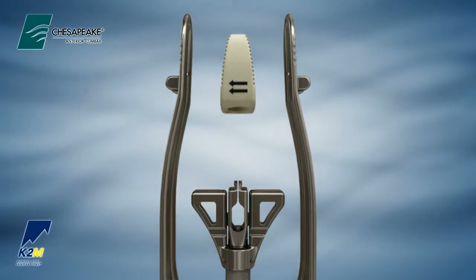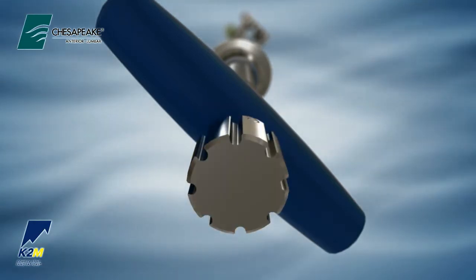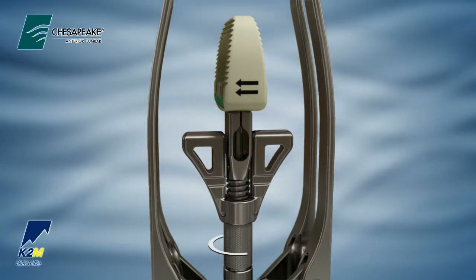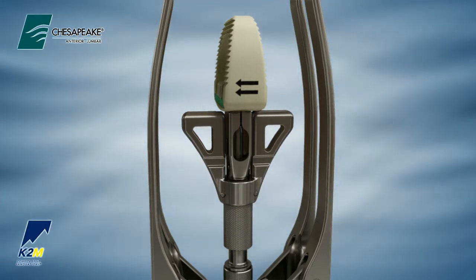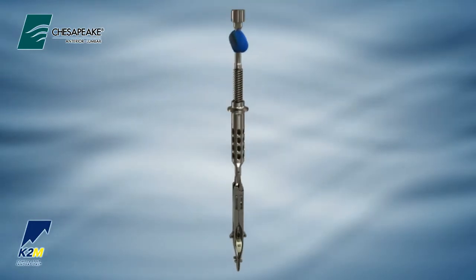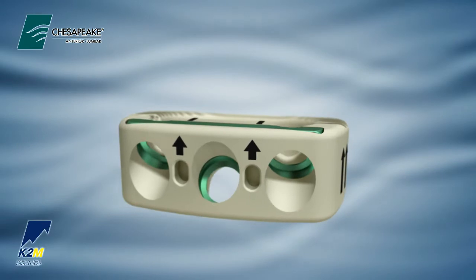Place the selected interbody onto the distal end of the Chesapeake modular tip. Turn the knob at the proximal end of the inner shaft clockwise to engage the interbody. Adjust the countersink depth on the anterior insertion ramp by rotating the larger knurled thumb wheel behind the countersink depth bar on the Chesapeake modular tip. Countersink may be adjusted from 0 to 6 mm. Rotate the anterior insertion ramp 180 degrees to close the distraction ramps. The anterior wall of the implant is marked with two arrows to indicate the orientation of the screws.